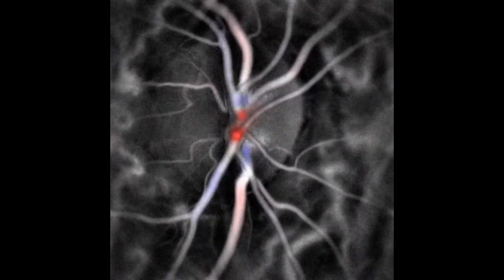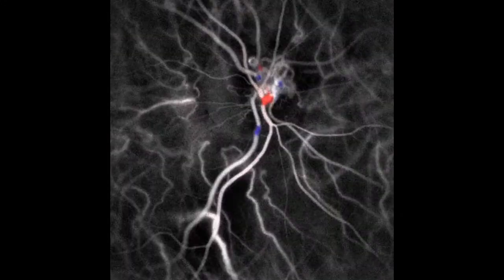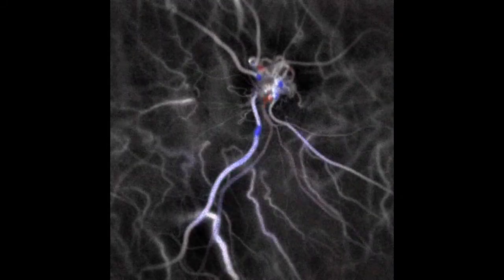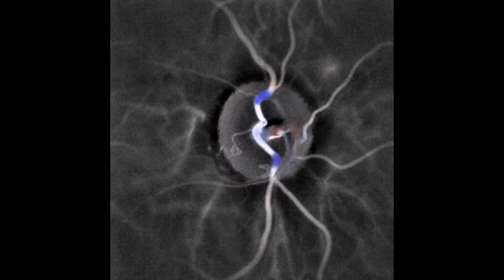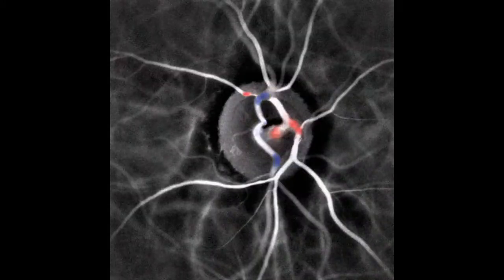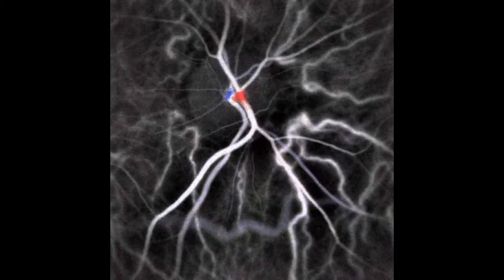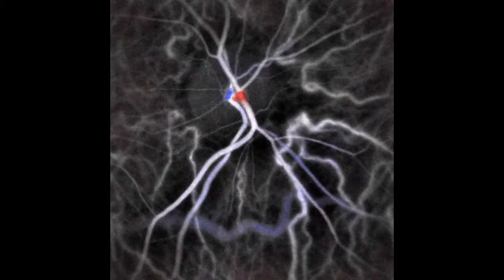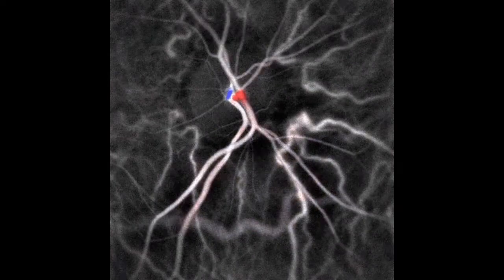And these are now dynamic examples of this blood flow contrast to show that it's also possible to use this contrast over time. So a single short-time window is enough to produce spectral asymmetry that leads to a good enough directional blood flow contrast.